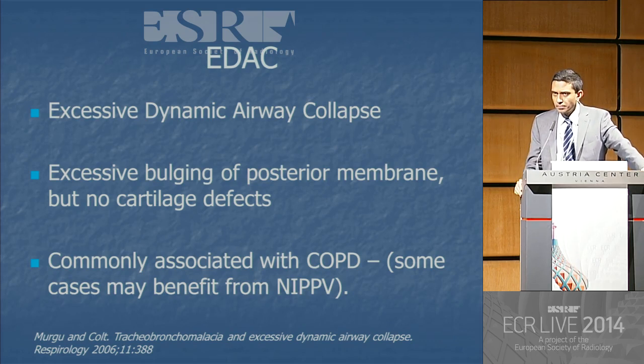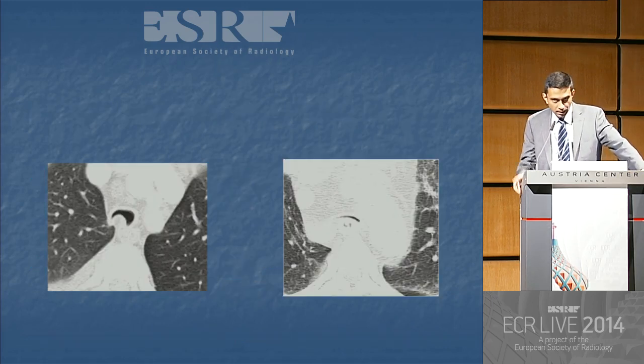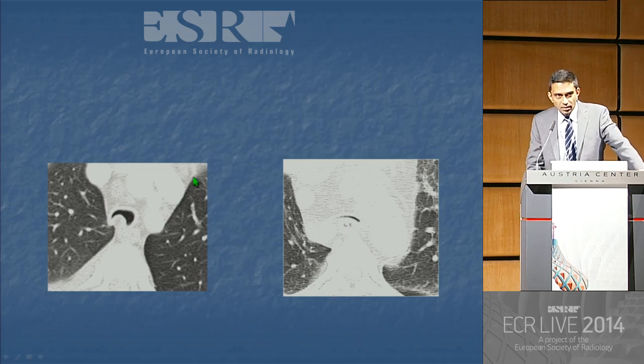Personally, I think it's not crucial to make the distinction. It's more important to identify the tracheomalacia. And I'll explain why it's difficult in a moment, but here's just an example of what you might call EDAC, very excessive posterior bulging of that posterior membrane compared to the example of tracheomalacia I showed you earlier. Now, the problem here is, what is the gold standard?